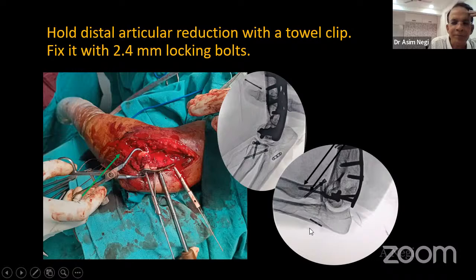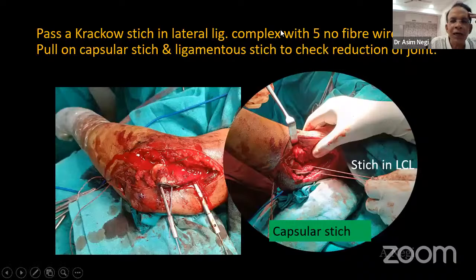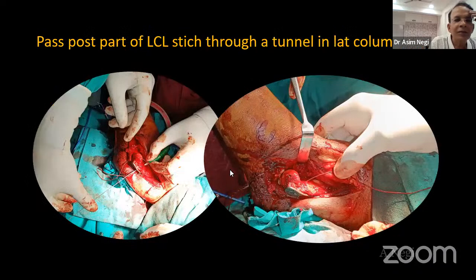Then you pass a Krackow stitch in the lateral ligament complex with a number 5 fiber wire. So make a nice good Krackow, at least 3 loops here. Bring it up. So you got 2 ends of the number 5 fiber wire in the lateral ligament complex. After that, you pull on the capsular stitch here in the ulna to check reduction of the joint. And finally, this is my capsular stitch being pulled. I have not yet tied it probably. Then pass posterior part of lateral ligament complex fiber wire through a tunnel in the lateral column.